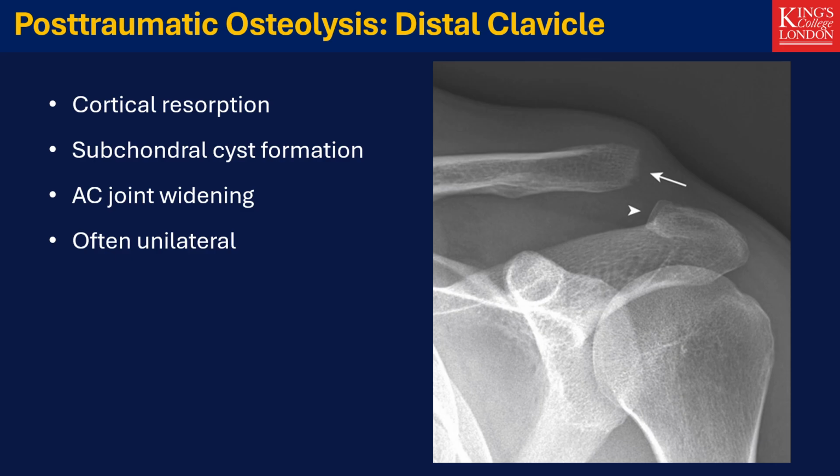If you see distal clavicular resorption after trauma, say it clearly. Findings consistent with post-traumatic distal clavicular osteolysis. Do not hedge with erosive changes, which creates unnecessary rheumatologic referrals.